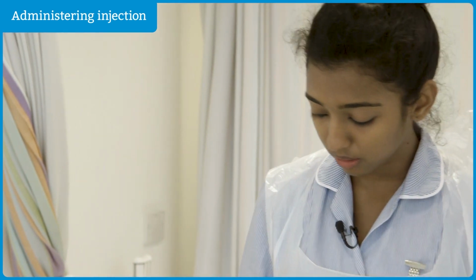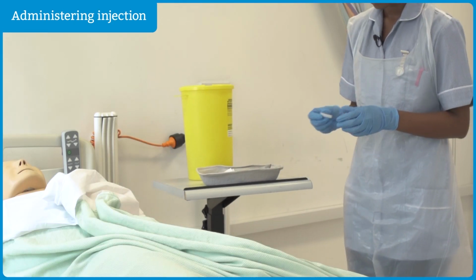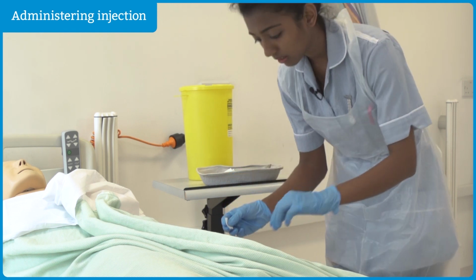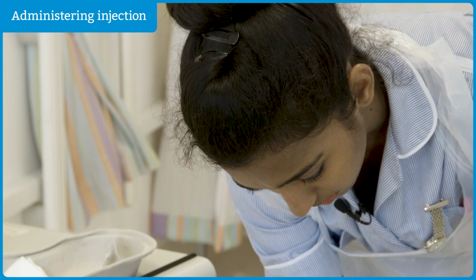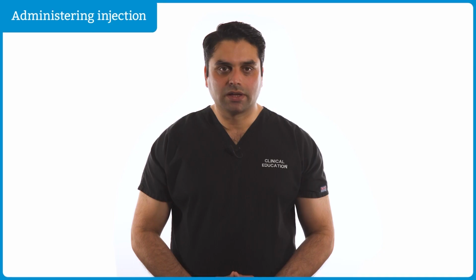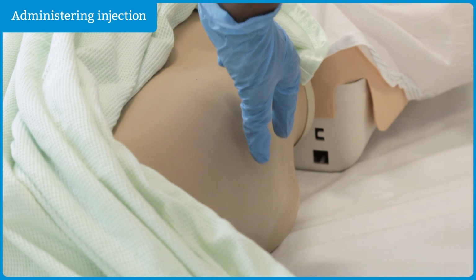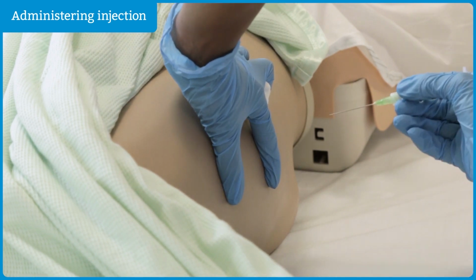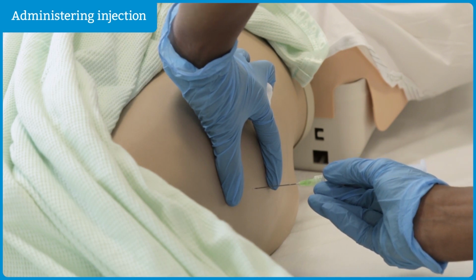So I take the alcohol swab and I clean the injection site for 30 seconds and allow it to dry for another 30 seconds. Check the patient is ready and talk through the injection process. So I'll be stretching the skin with my non-dominant hand, and I'll be holding the syringe like a dart, and I'll be going in at 90 degrees.